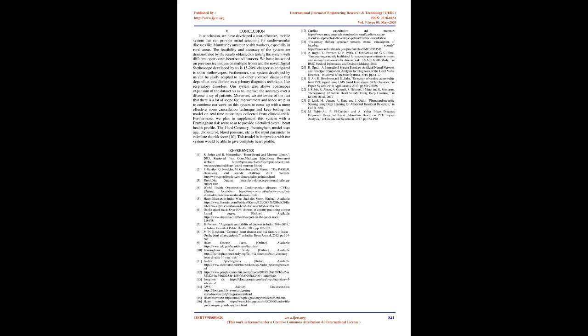Conclusion. In conclusion, we have developed a cost-effective, mobile system that can provide initial screening for cardiovascular diseases like murmur by amateur health workers, especially in rural areas. The feasibility and accuracy of the system are demonstrated by the results obtained on testing the system with different open-source heart sound datasets. We have innovated on previous techniques on multiple fronts, and the novel digital stethoscope developed by us is 15 to 20% cheaper as compared to other stethoscopes. Furthermore, our system can be easily adapted to test other common diseases that depend on auscultation as a primary diagnosis technique, like respiratory disorders.